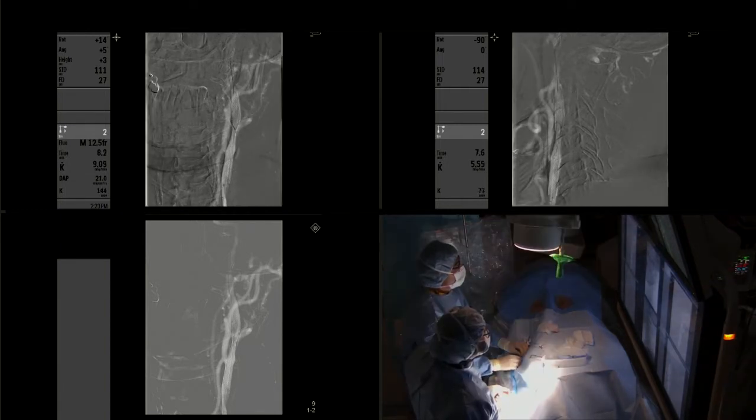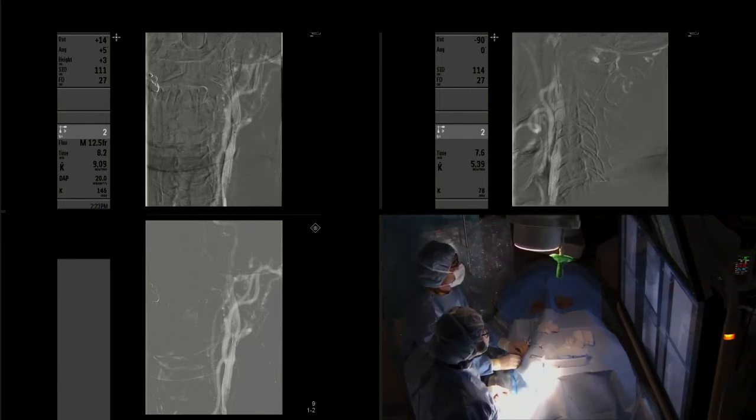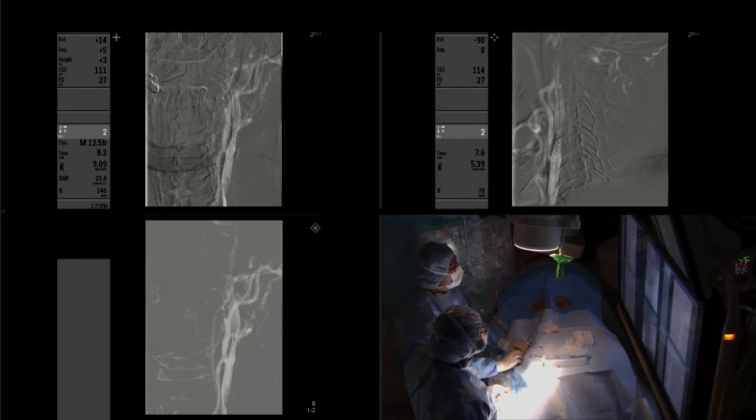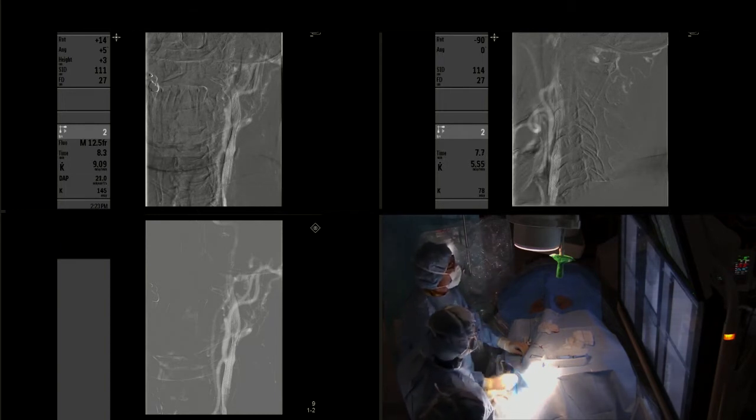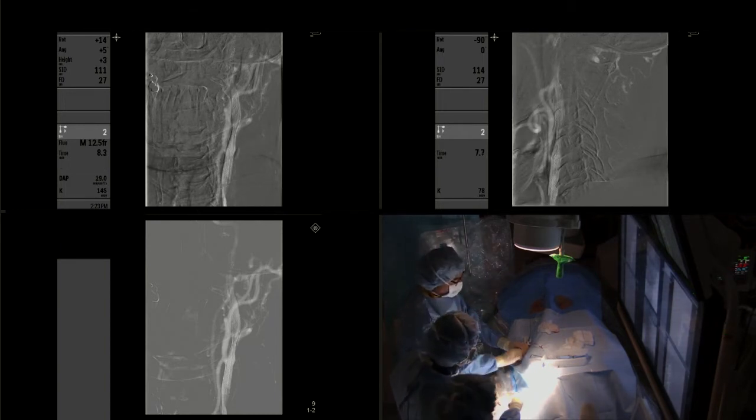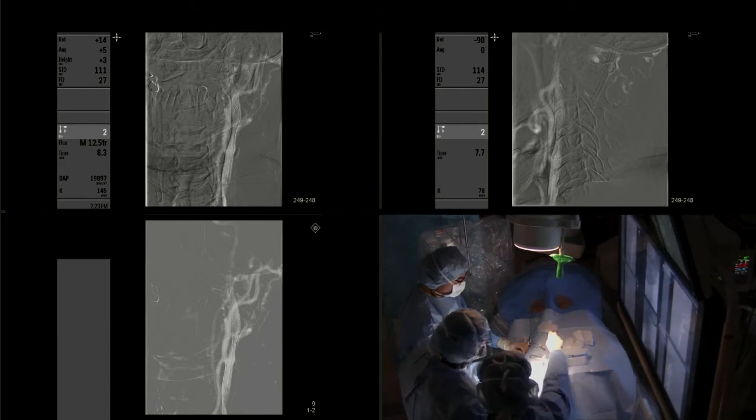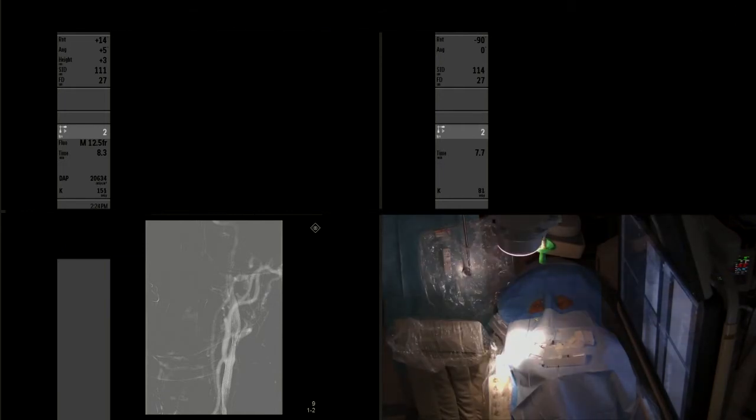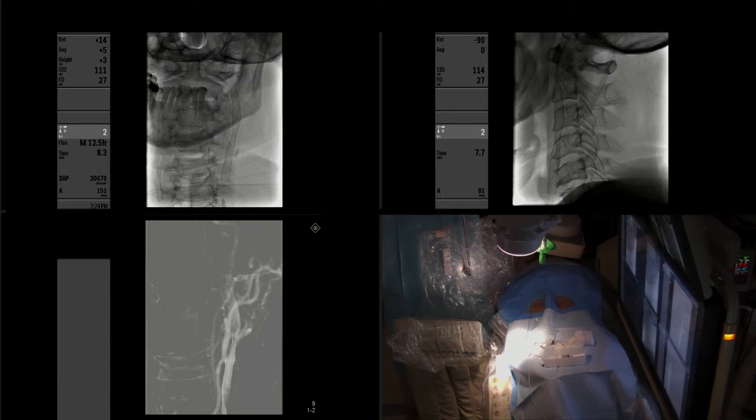And now we are at the part in which we are retrieving the distal protection device and removing it from the body. It is very important that we obtain control angiography.